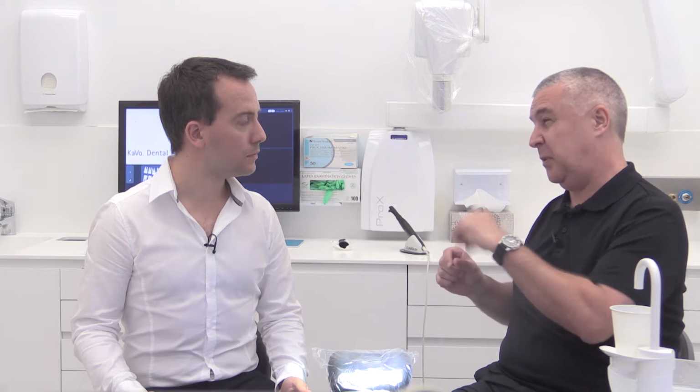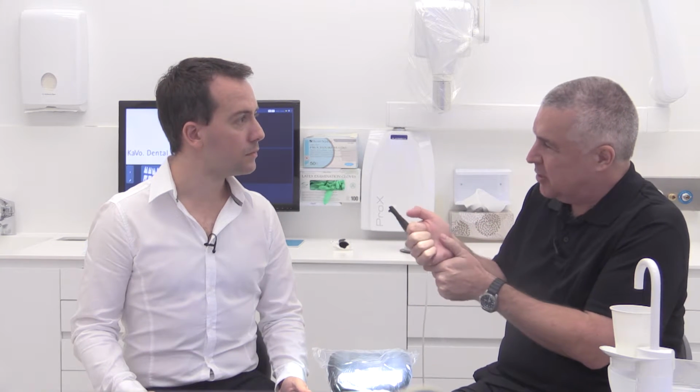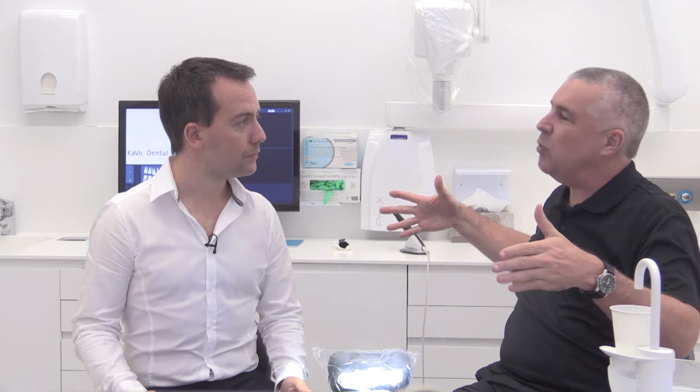Another one, do you use a DIAGNOcam every checkup? I mean, you can. I think it's a very easy thing to do. You need to allow some time for it in the way that you've scheduled your checkup. So if your standard examination visit is this long, you need to factor in, if you're going to assign images per tooth, that's going to take you time to literally click your way around the different teeth in the mouth. So you might want to rebuild the length of your appointment before you just simply throw it into your standard appointment time and then find that you're running late all the time.